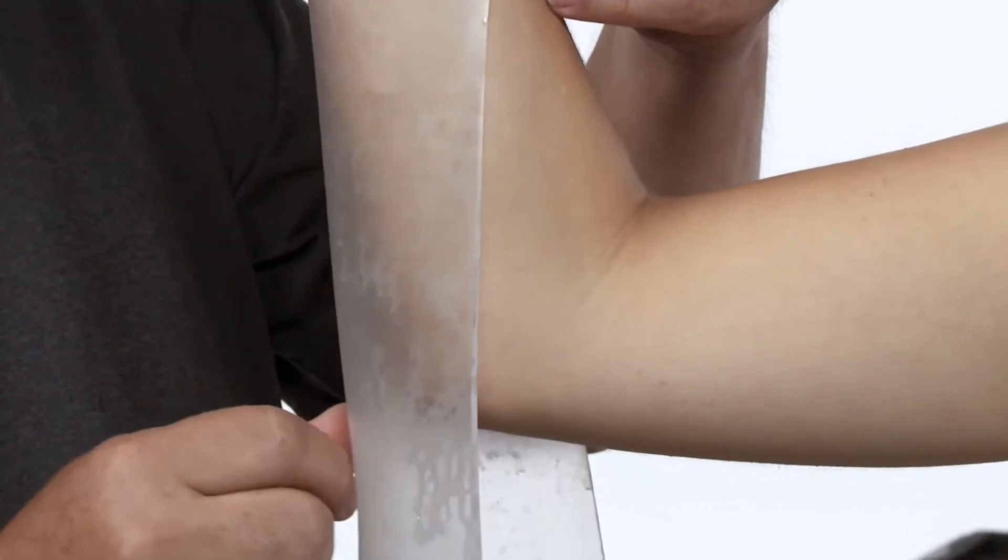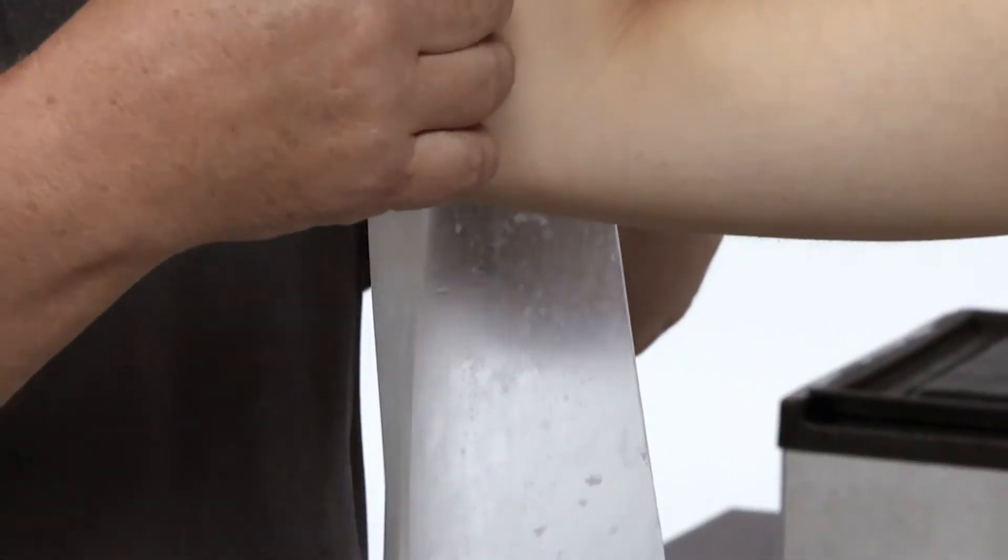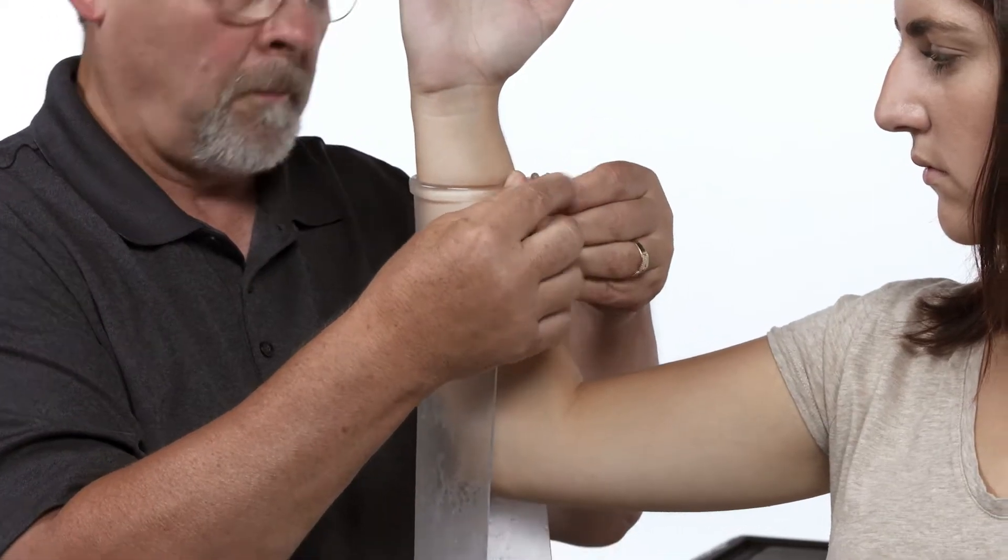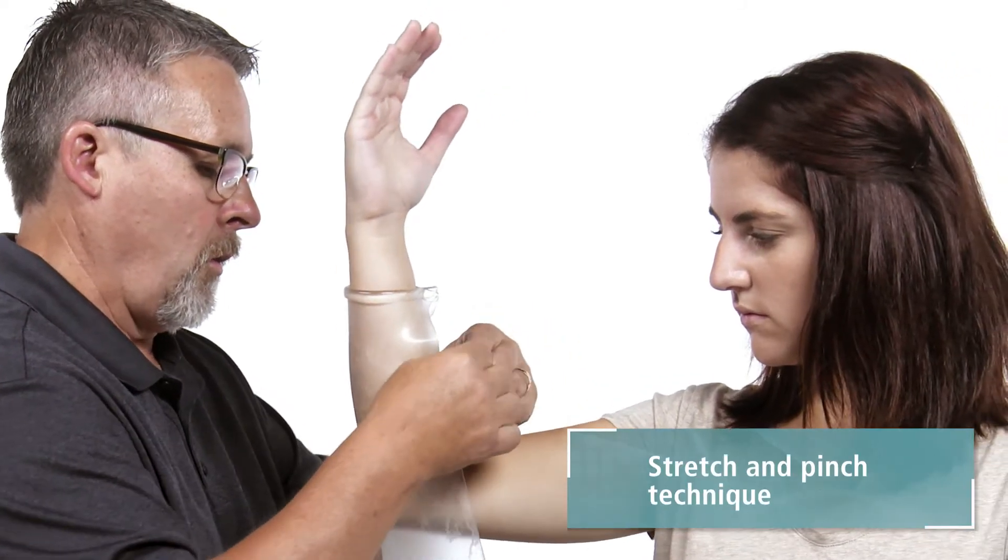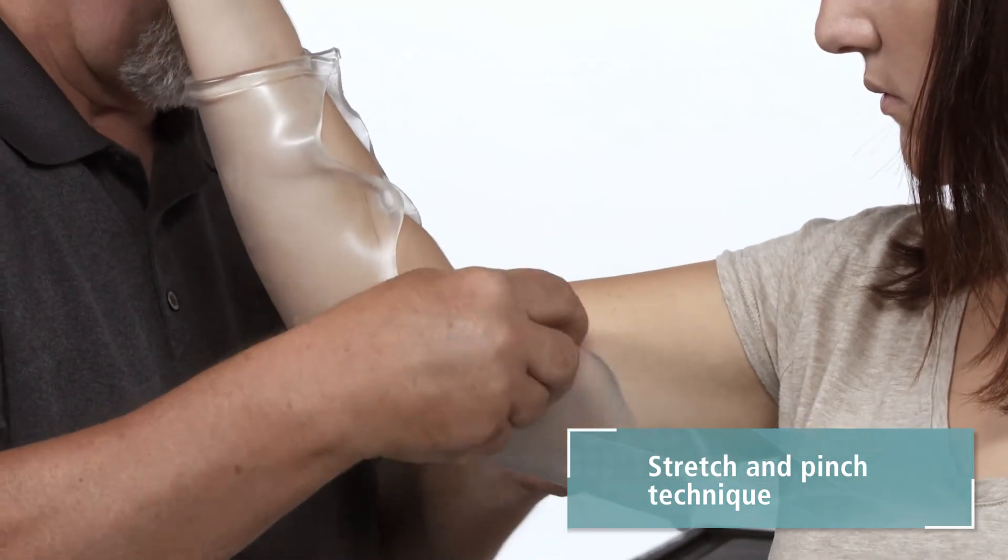The material is heated and clear so you can place the grease pencil mark over the patient's olecranon. With the mark lined up with the olecranon, use the stretch and pinch technique to stick the borders together.